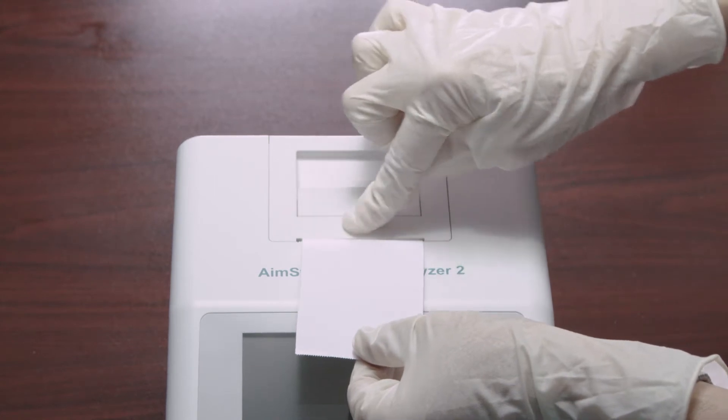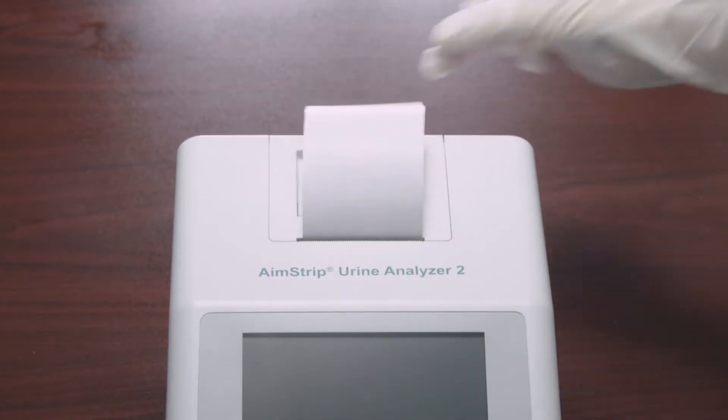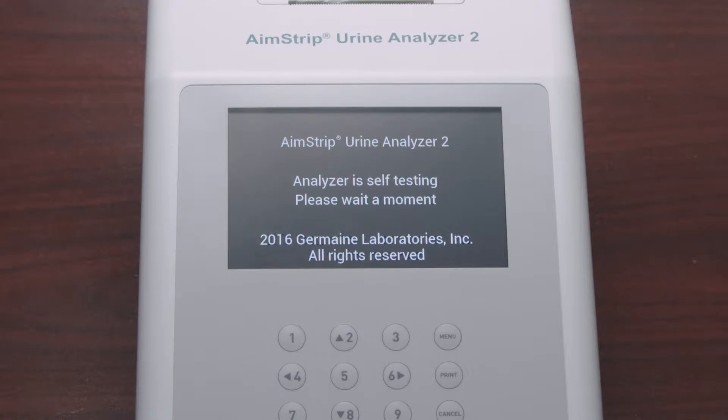Return the printer cover to its original position and snap it firmly into place. Once the analyzer is turned on, it will run a self-test.